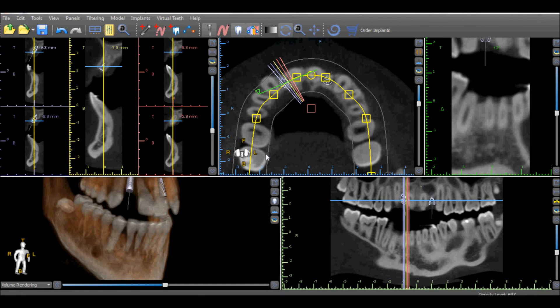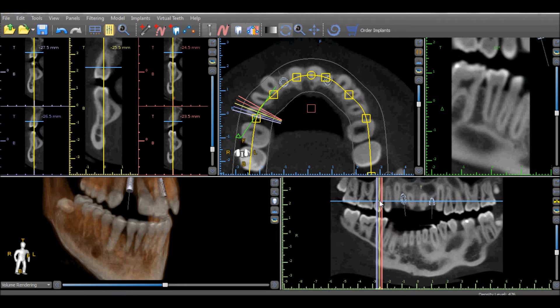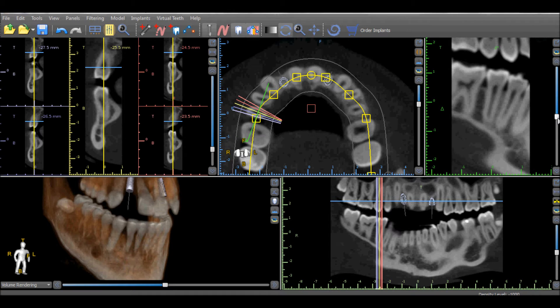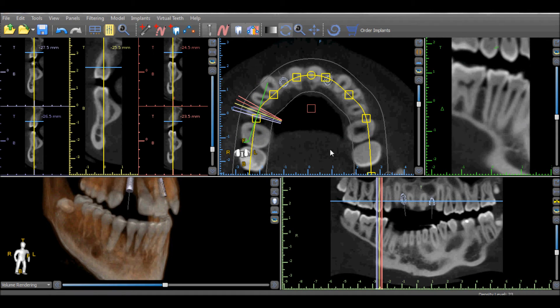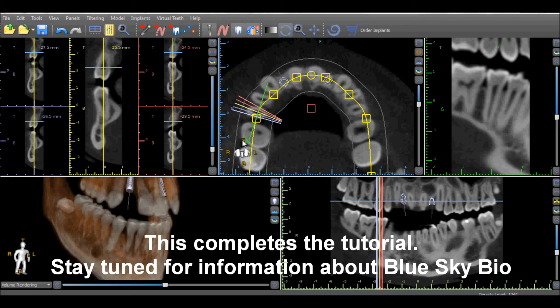The tangential view can be used to analyze any element of the patient's anatomy simply by left clicking on the desired positioning in any view, and then rotating the tangential view by using the slider to the right of the view or by grabbing the indicator in the axial view and rotating it accordingly.